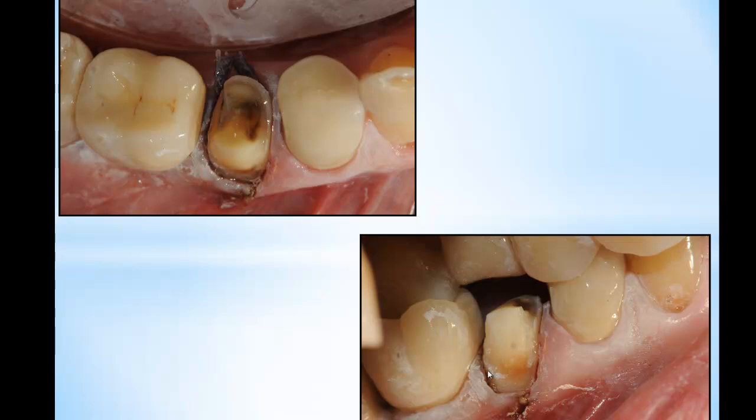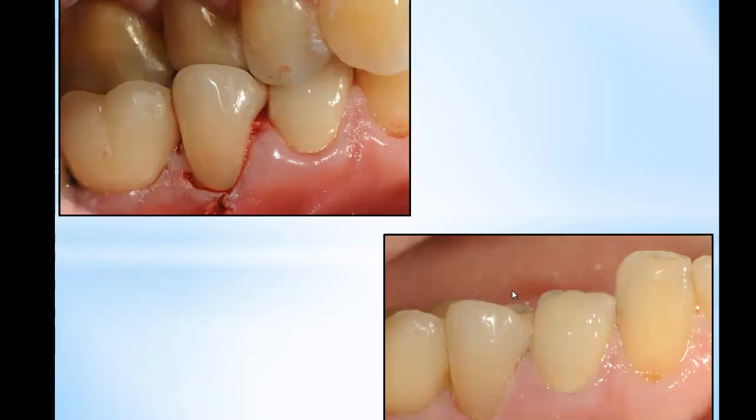This is from a cervical view. You can see I have enough clearance here, and this is the final restoration. This is the deep insertion, and it's one week after. You can see the soft tissue healed fast, and again, I didn't violate any biological width. Looks perfect. Closed everything, removed all the decay. But again, it was a little bit of a challenge for me to do restoratively. I had time, so I let myself play with it. Can I do something, not just by generic copy?